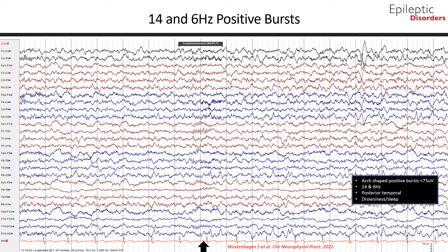In this bipolar montage EEG, we will go over 14 and 6 Hz positive bursts, which are bursts of arc-shaped waves that most commonly occur at 14 and/or 6 Hz. They are generally seen over the posterior temporal and adjacent areas of one or both sides of the head during sleep. The sharp peaks of their components are positive with respect to other regions, and amplitude is generally below 75 microvolts. The 14 and 6 Hz components may be observed independently. The 6 Hz component prevails in early childhood and adulthood, while the 14 Hz component is more prominent in older children and adolescents. This pattern occurs most commonly in children after age 4 and adolescents, declining in adulthood, and typically occurs during deep drowsiness and very light non-REM sleep.